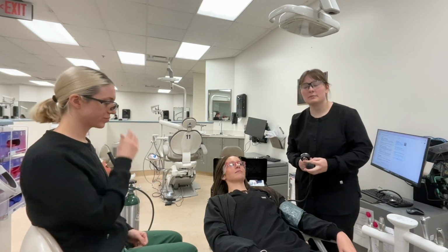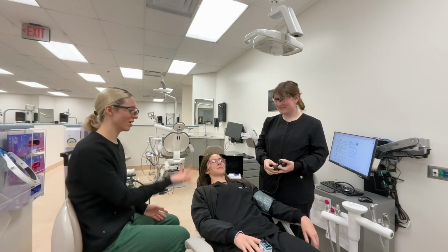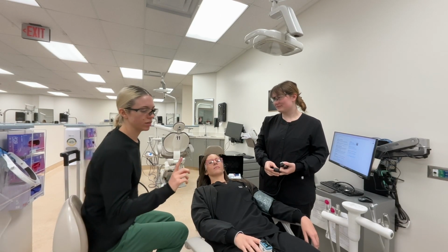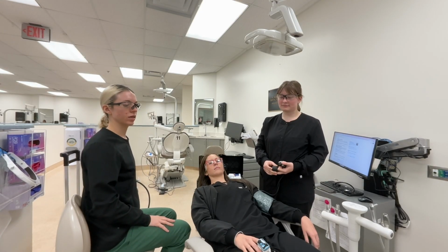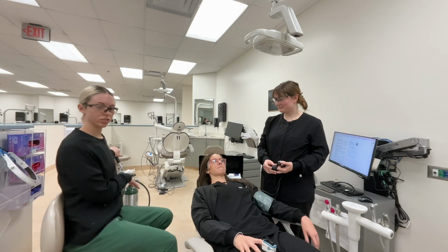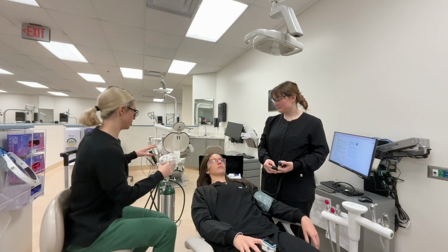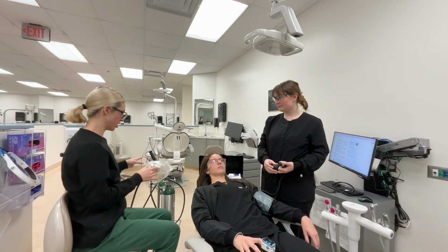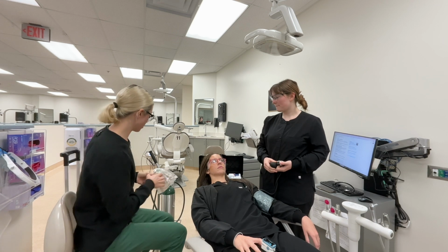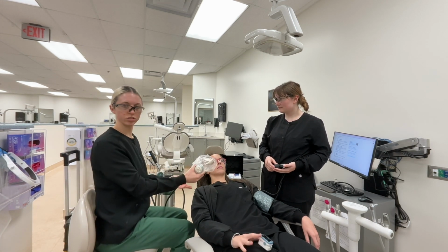And then I'm also going to be documenting her blood pressure and her pulse every 5 minutes. Yeah, vitals. And then if the pulse ox is reading about 93 or less, a pretty low reading, I'm gonna go ahead and get the oxygen over here. While she's doing the vitals, I'm just gonna get the mask out. I'm gonna do the procedure for the oxygen, so I'm gonna turn it on the correct way, make sure it's the correct pressure, and then, if she's conscious, I'm just gonna ask her if she wants to hold it. Would you like to hold it?